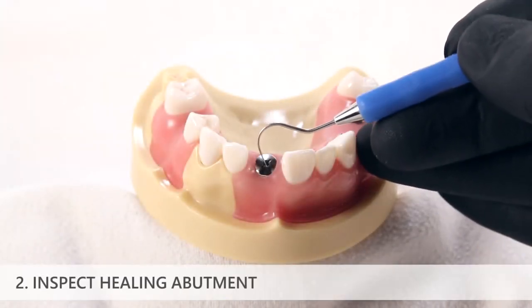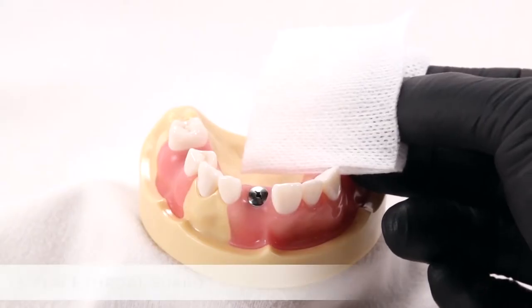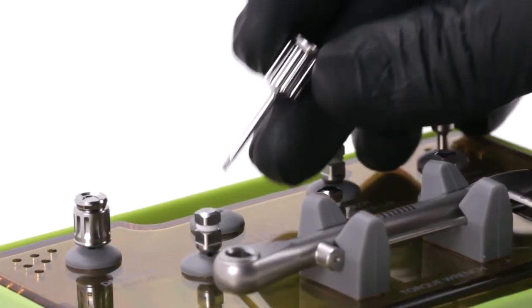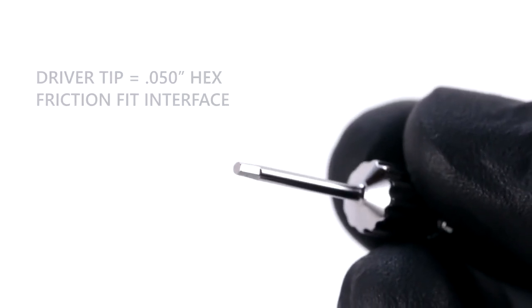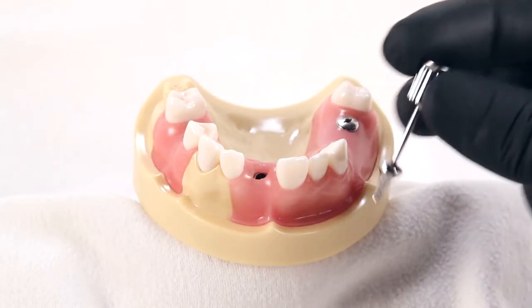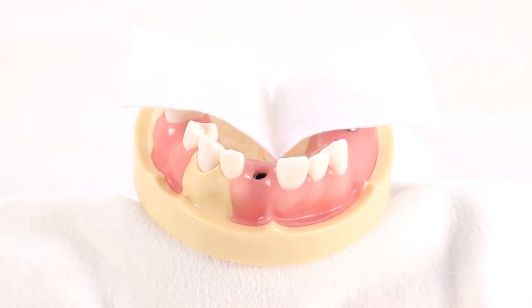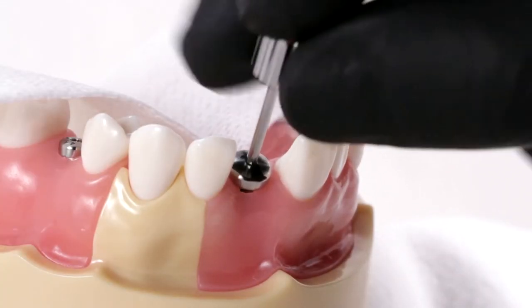Inspect the healing abutment intraorally and ensure that any debris is removed from the hexed slot in the top of the healing abutment. Place a 2x2 gauze across the back of the mouth to act as a throat guard for patient safety. The prosthetic driver utilizes a .050 inch hex with a friction fit interface, allowing small restorative components such as healing abutments or prosthetic screws to be picked up by the driver tip with minimal risk of slipping off. Do not carry components into or out of the patient's mouth by the driver tip without a throat guard. If components slip, there may be debris in the slot or the components may be old and worn out.